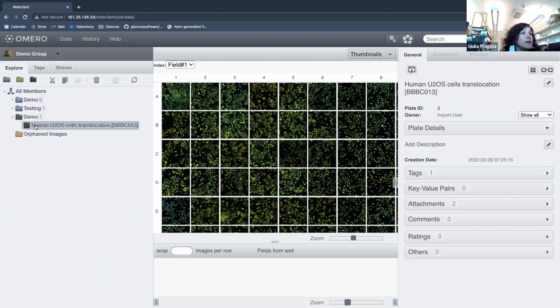When I use CellProfiler, for example, it is easy to tell it how to get that information from the name of the image, because it has the well. Mm-hmm. And so I was wondering if there was something similar also here, or you had to actually write a code for it. Or maybe it's available somewhere and I can just use that code.